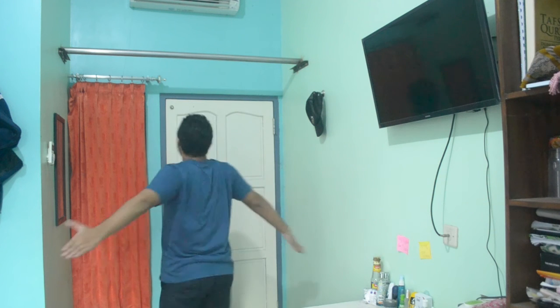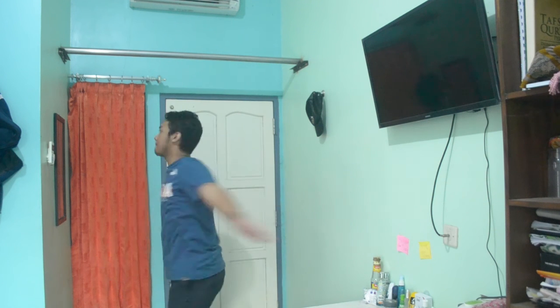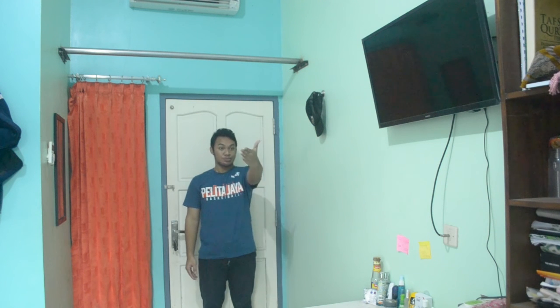Well, here is the procedure for the visual acuity test with the Snellen chart. The first step is to make sure that the room is comfortable. Make sure too that the size of the room is more than 6 meters. Secondly, you can ask the patient to stand or sit about 6 meters from the Snellen chart.